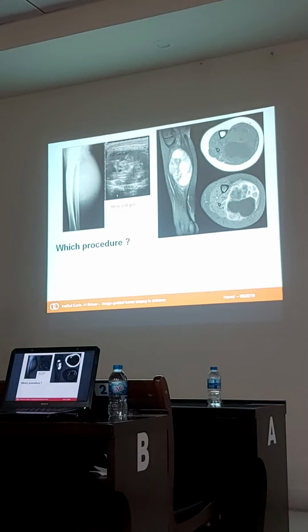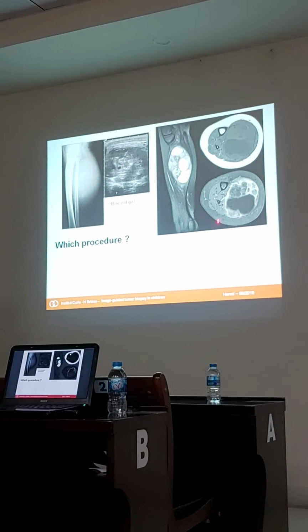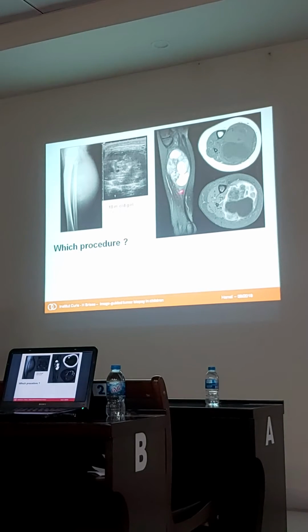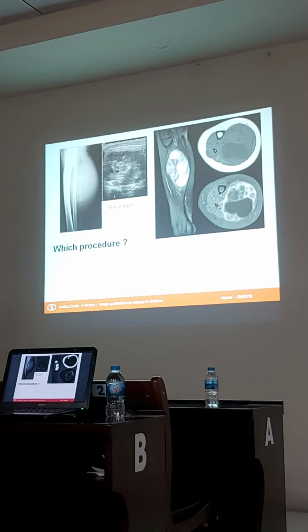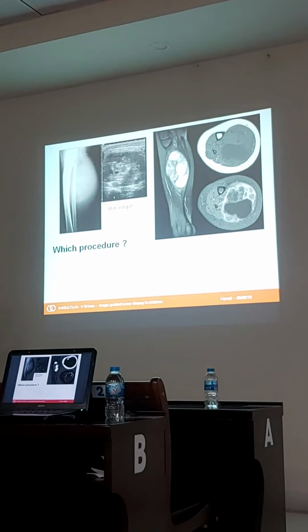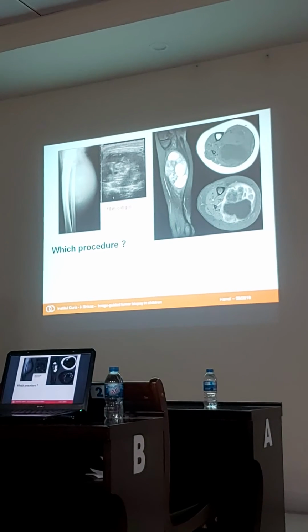Also, you can get a lot of cells with fine needle aspiration, but it's very important to do the biopsy with ultrasound guidance to avoid these large necrotic areas, and this is best obtained with image-guided needle instead of surgery. Surgery may be performed here, and you can only get some liquid, so you can exactly put your needle here in a posterior approach and get the diagnosis.